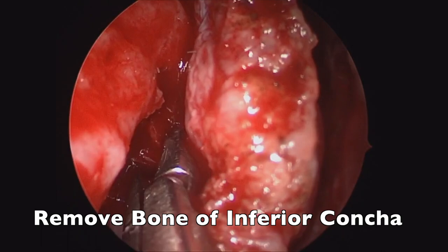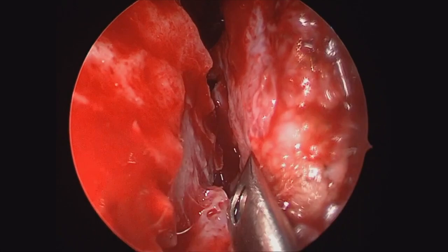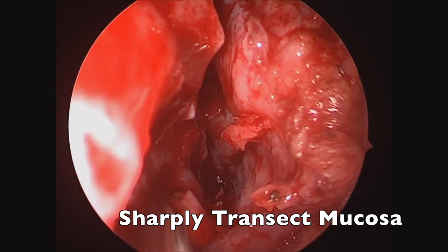In general, we'll dissect this off the bone of the inferior turbinate and then also remove that bone in a piecemeal fashion. Once that's been dissected off the inferior turbinate bone, that can be removed, and then that is actually continued onto the inferior portion of the bone. On the inferior aspect, you can complete this once you reach the inferior aspect of the bone, if that's enough distance for you. Otherwise, you can peel out the bone and take some of the medial portion of the inferior turbinate mucosa with you as well.